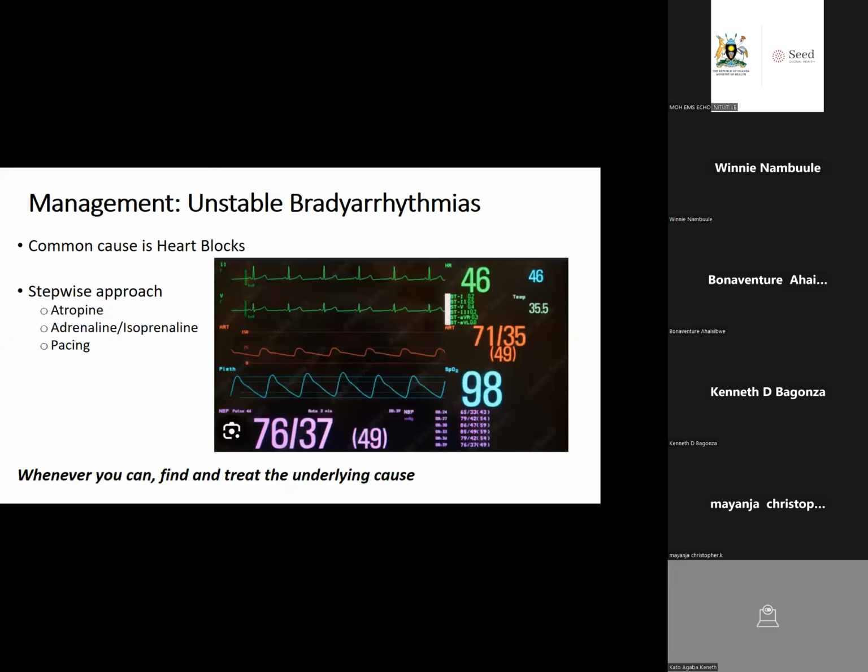Normally we will start with 60, because 60 is the lowest acceptable normal heart rate. You don't want to have a patient who has a heart rate of 35 and take them immediately to 80, because you will cause them problems. So you start at 60, and there's a whole process to pacing. Essentially, you're looking for electrical capture, looking for physiological capture, until the heart begins responding to your external pacing.